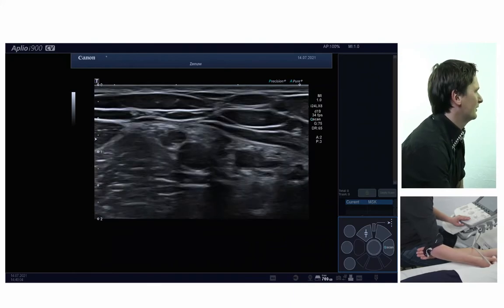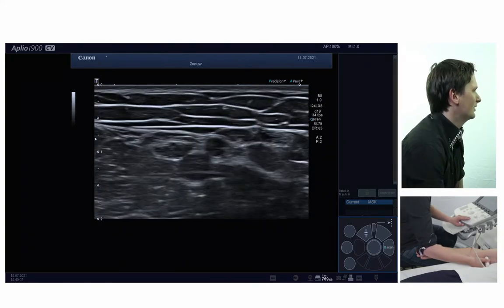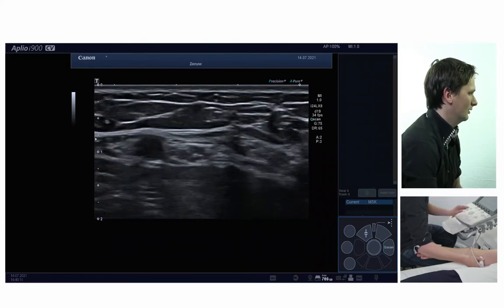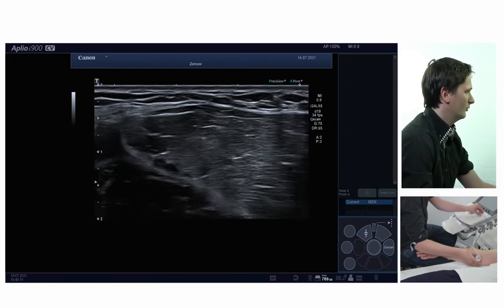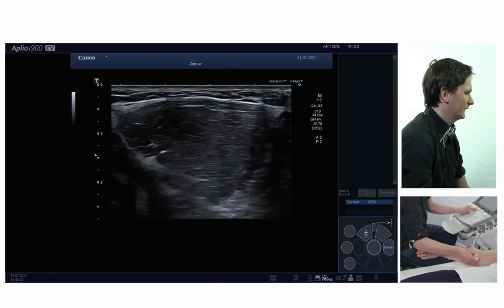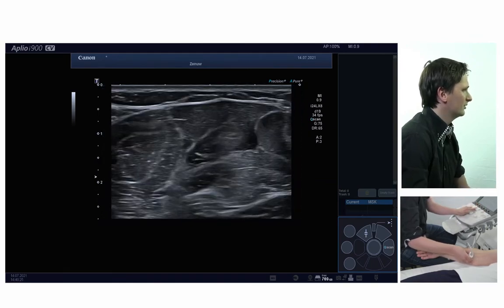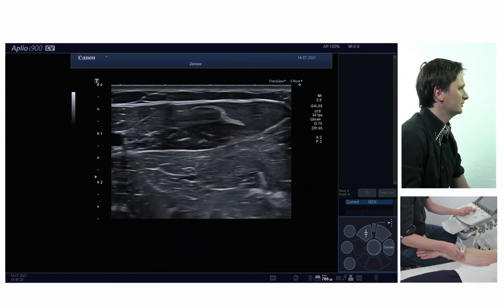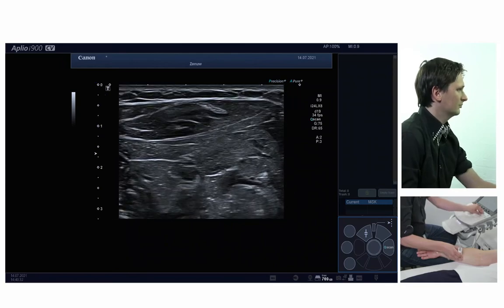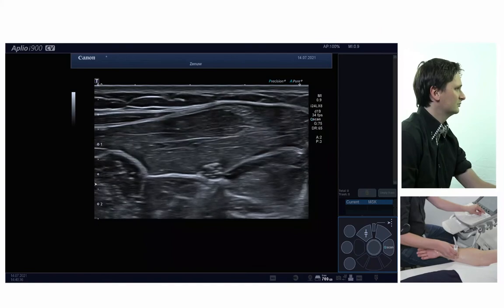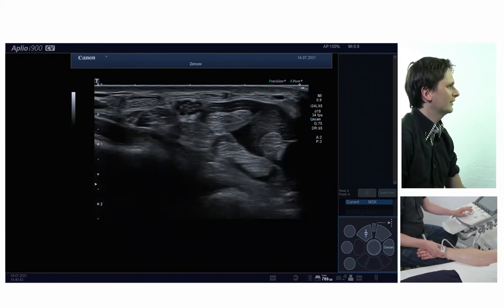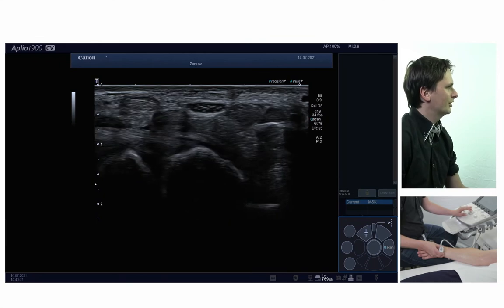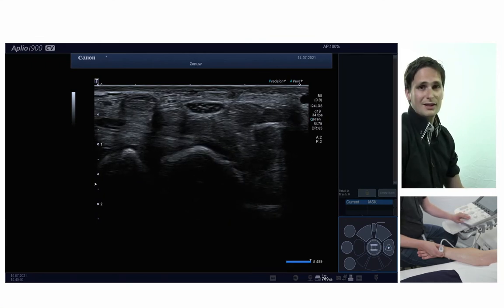Let me follow it just a little bit more proximately, and then I'll go back. As you can see, the median nerve is a nerve you can really nicely follow along a very long tract in the arm, all the way back to the carpal tunnel. Here it will make the C-turn again, and here we arrive just proximal of the carpal tunnel. So that's it — a quick guide on how to scan the median nerve. Thanks a lot.